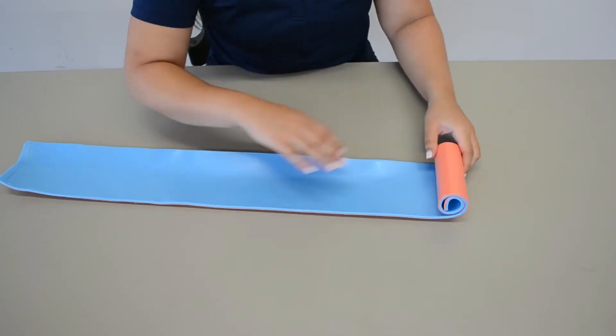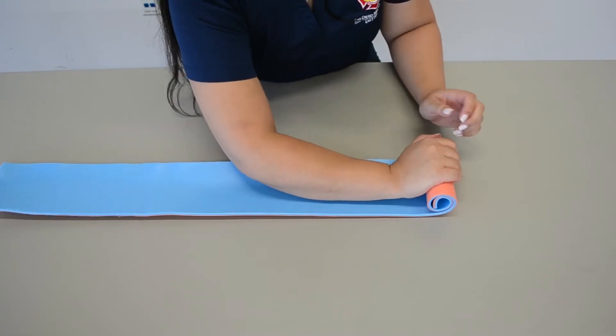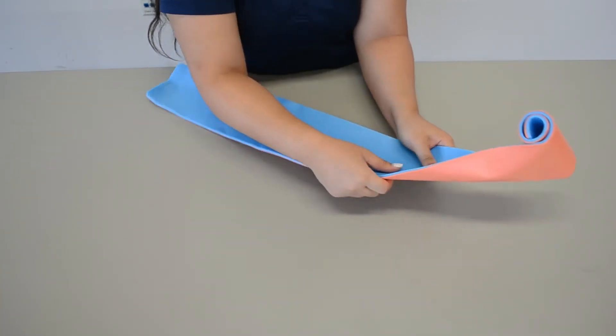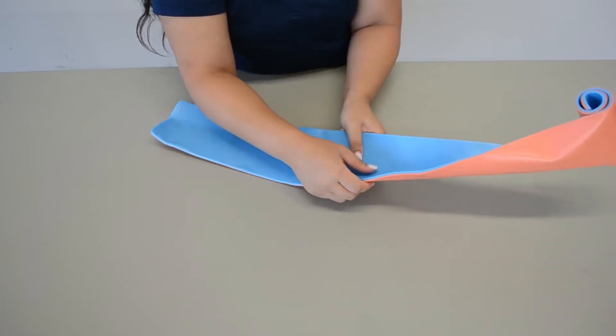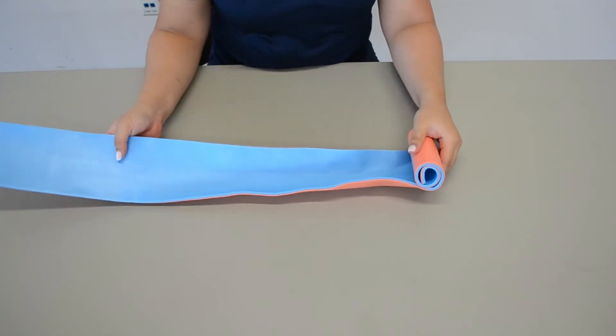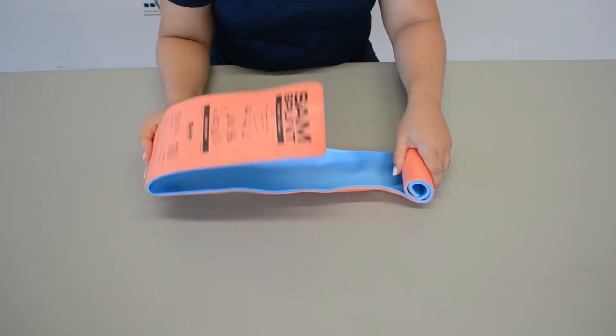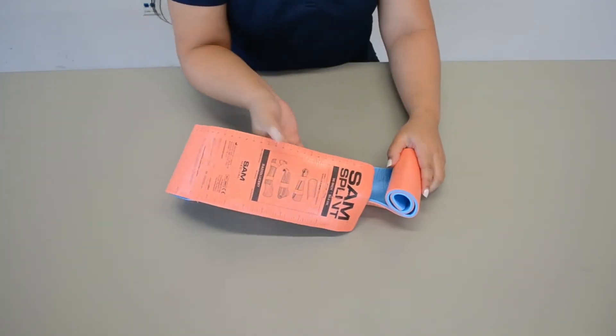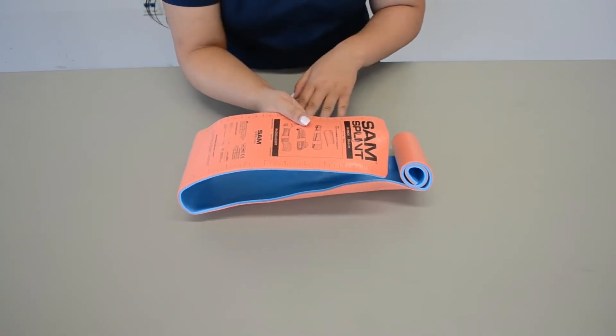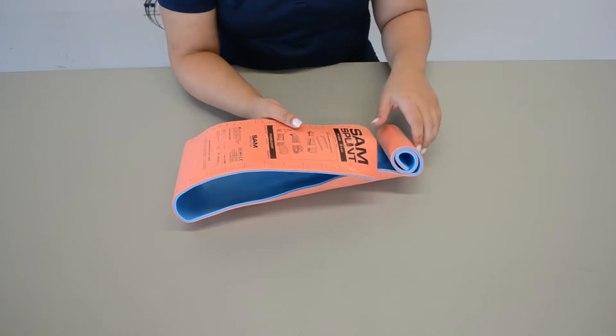So you're going to go ahead and roll up this and have the patient grab it on like this. And then you're going to bend to make a little crevice for the arm to go on. So the patient's arm can rest in there, and then you're going to fold this over their elbow like so. And that's your sugar tong technique. This is a point where you would pad the voids and then wrap it with gauze.